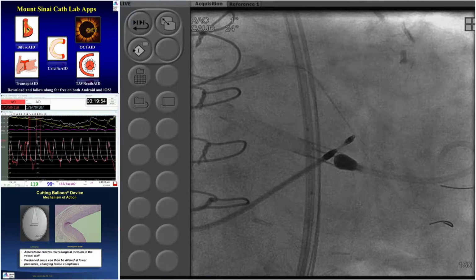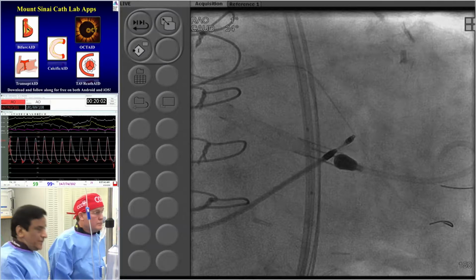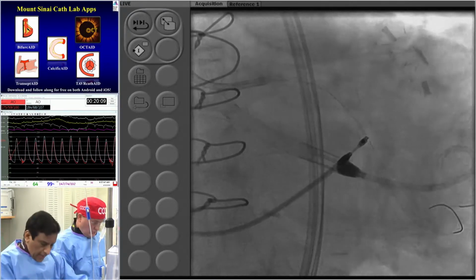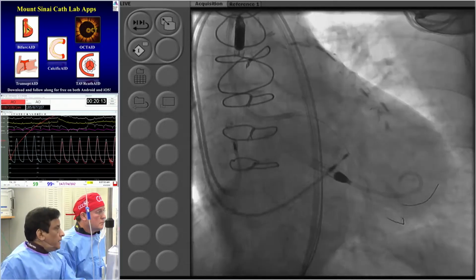No, I think you can put 2 stents, one from the proximal circ to the left main, and second into that OM, the branching OM, although the superior branch of that OM may need to be taken care of. We are going to take a picture now, and let's magnify it a little so everybody can see better.